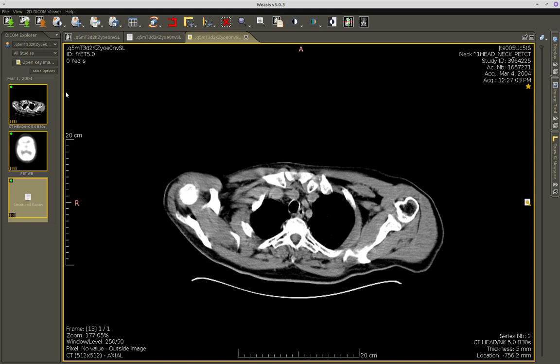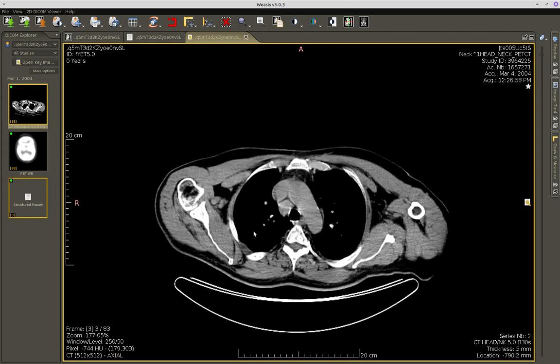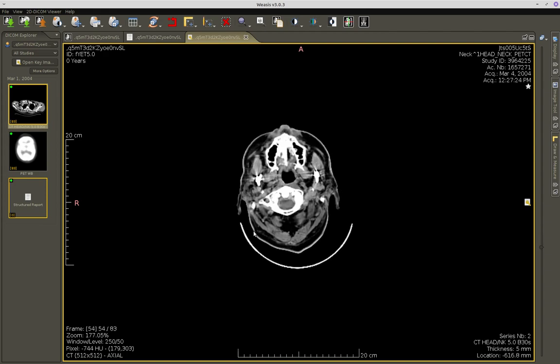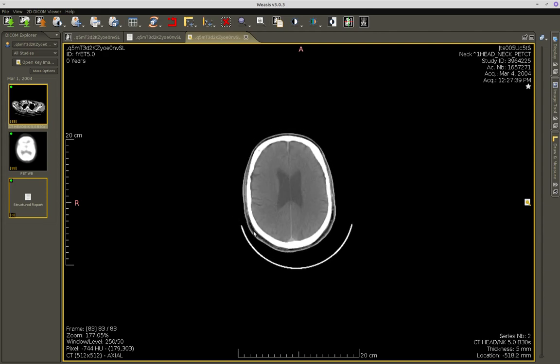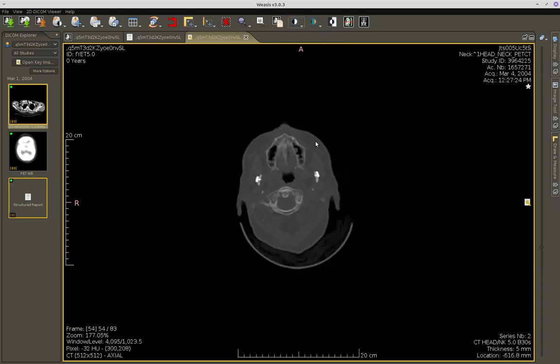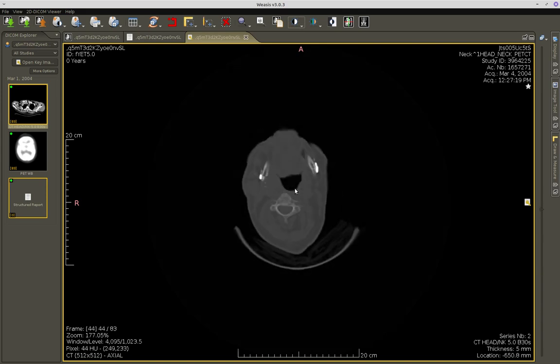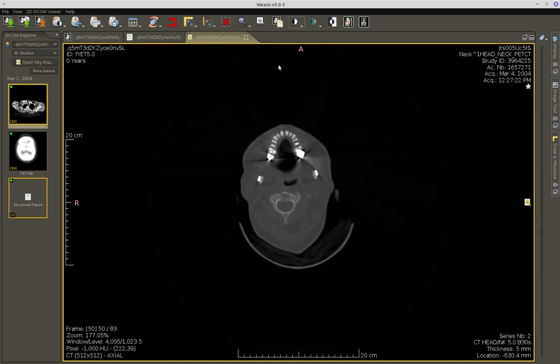This is the last thing that we do. I actually demo the visualization on my training courses. Here you can do a lot of things like changing the window and the scale, the level. It's very interesting. This is an open source visualizer.